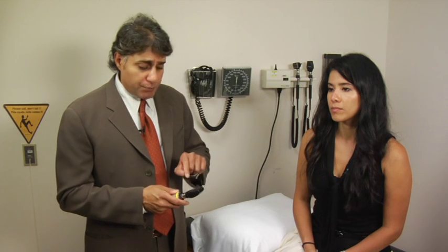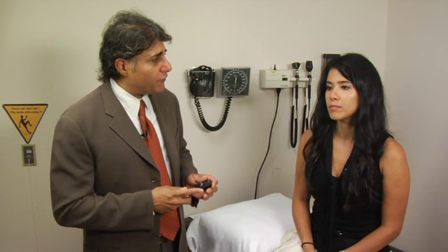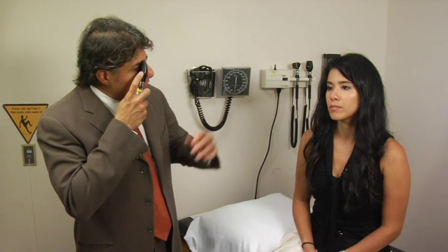So what I'd like to do is I'll have Dr. Zhao look straight ahead, and if the patient is wearing glasses, we ask them to take the glasses off. If you, as the examiner, are wearing glasses, you certainly can keep them on, or you can take them off and actually put your refractive error right into the direct ophthalmoscope. So once I've had Dr. Zhao look straight ahead, I will begin my examination by first looking at the red reflex from about an arm length away.